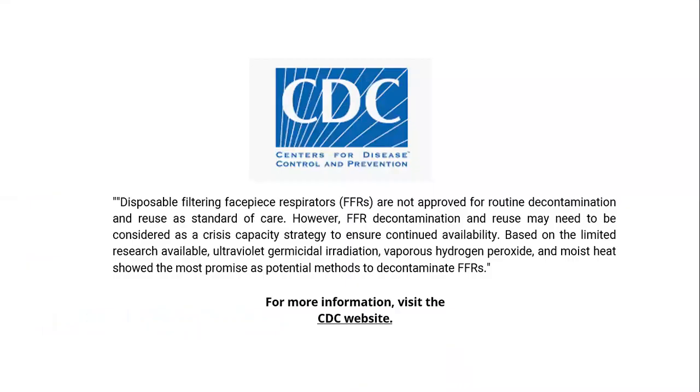This message from the CDC is important to understand and keep in mind: disposable filtering face piece respirators, also known as FFRs, are not approved for routine decontamination and reuse as standard of care. However, FFR decontamination and reuse may need to be considered as a crisis capacity strategy to ensure continued availability. And based on the limited research available, ultraviolet germicidal irradiation, vaporous hydrogen peroxide, and moist heat showed the most promise as potential methods to decontaminate FFRs.